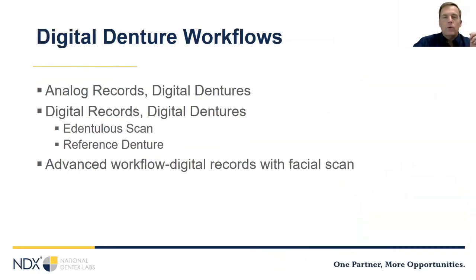So let's talk about some of the digital denture workflows that are out there right now. There's a question about how do you mark the post-dam soft palate on the digital format. Depending on the scanner, sometimes you guys can scribe a mark on the impression, which can be helpful. It kind of depends on the case.